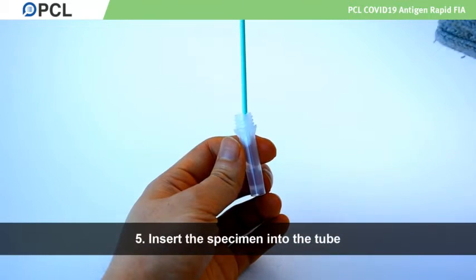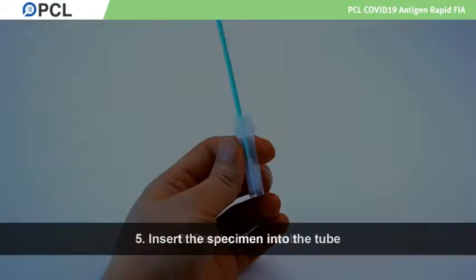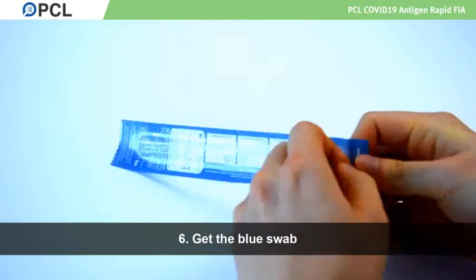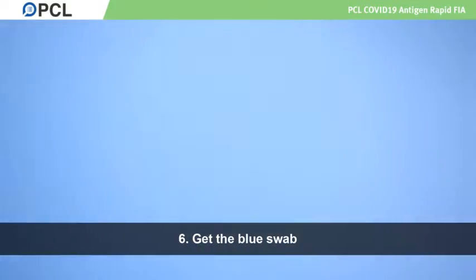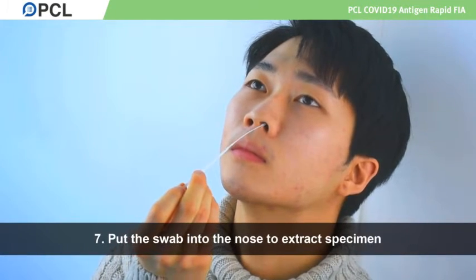Insert the specimen into the tube. Now, get the blue swab intended for nasal use. Be sure to not touch the cotton. Put the swab deep into the nose to extract specimen and insert it in the tube.